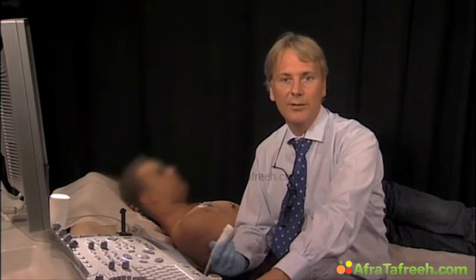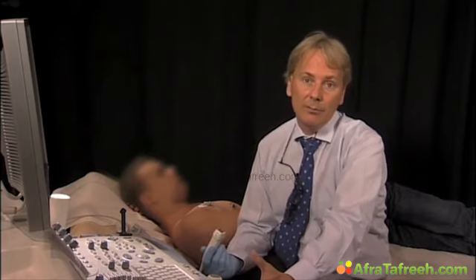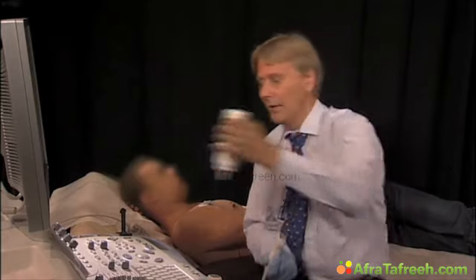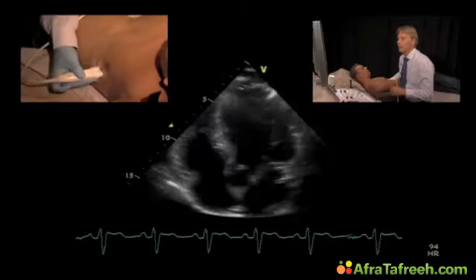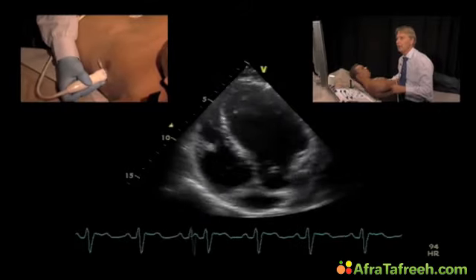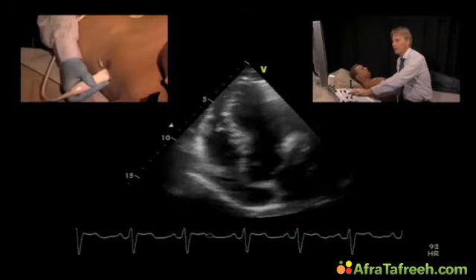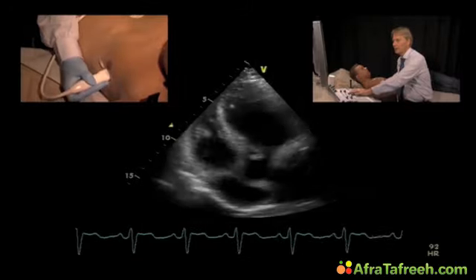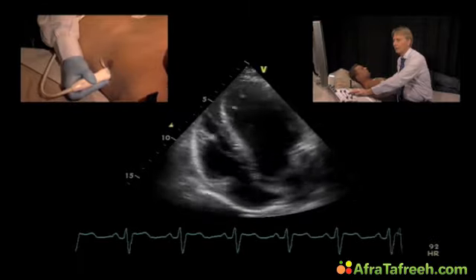I will now show you how to use the continuous wave Doppler spectrum to quantify the severity of aortic regurgitation, and I also want to show you how problems can arise and how difficult it sometimes can be, and what the limitations of this technique actually are. So, in principle, you would start with a 5-chamber view. Try to orient the 5-chamber view in such a way that you have a parallel orientation towards the ultrasound beams.